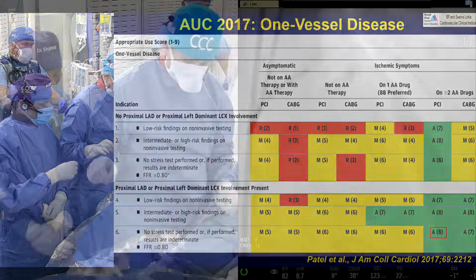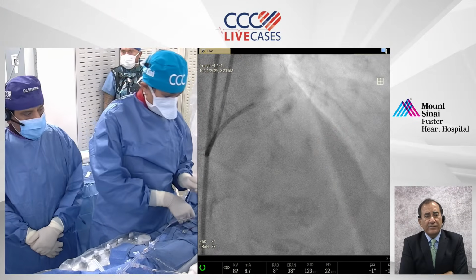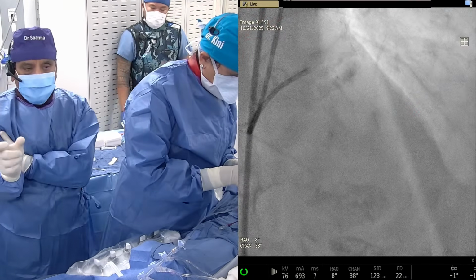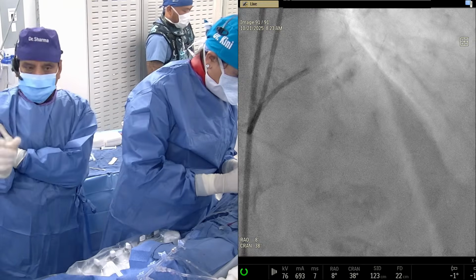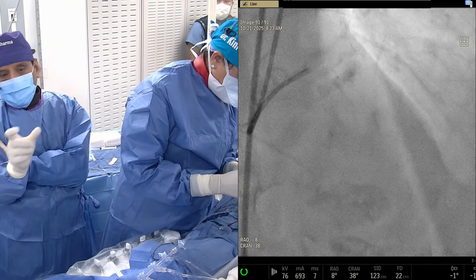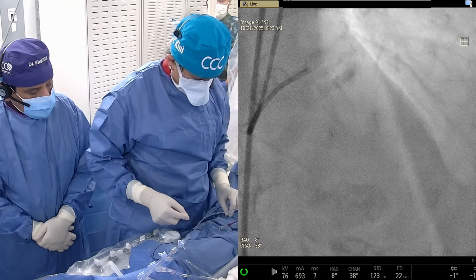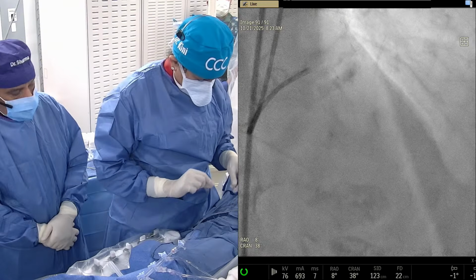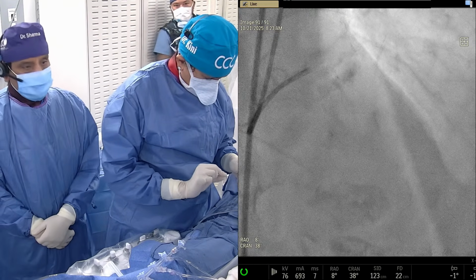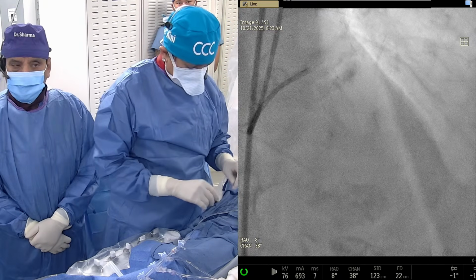That used to be a problem more in the circumflex distribution. You're noticing it even in other areas? LADs, because you know what they do, somehow, although they should be able to give the gradient. Now there is clearly a new system compared to HeartFlow, and that actually is going to give you the gradient of any lesion rather than giving us the complete FFR. And they say that a gradient drop of FFR of 0.2 means significant. But I have seen a lot of LAD positivity with minimal disease in the LAD.